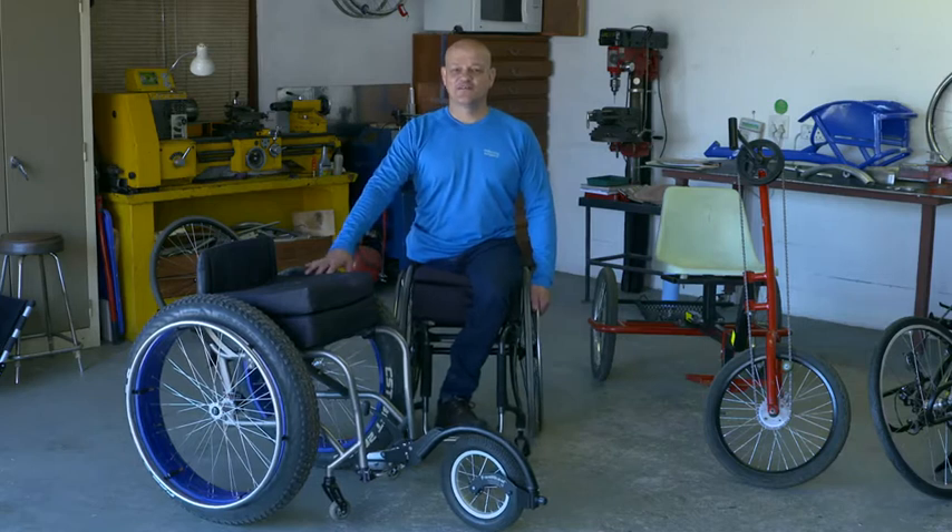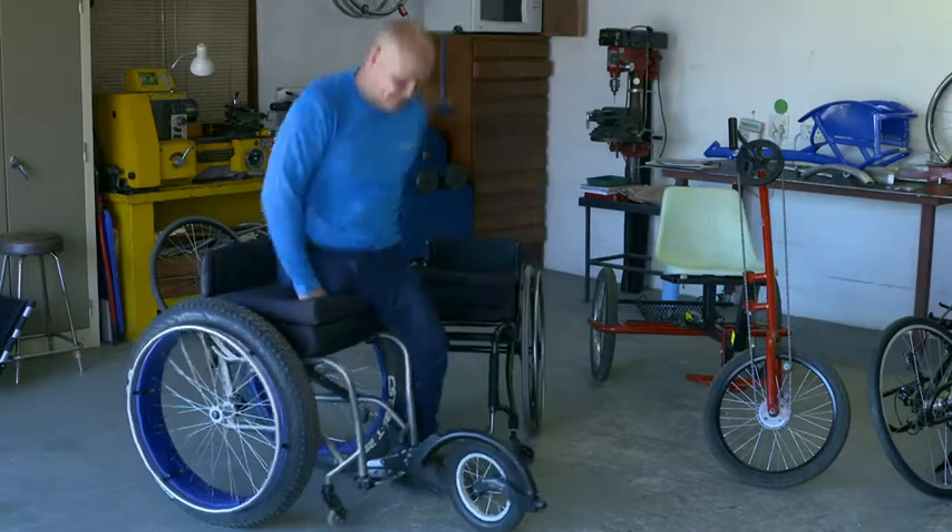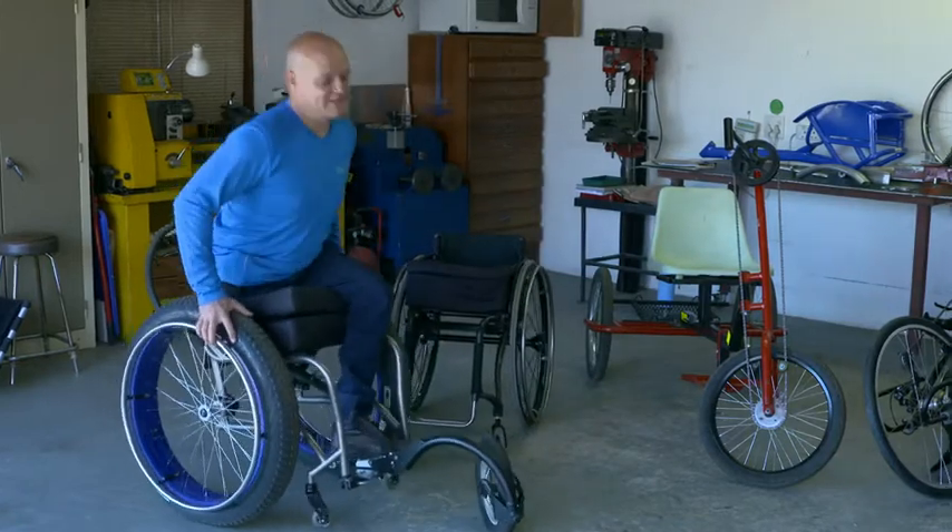This is my off-road version 4x4 wheelchair that you can use the fat tyre wheels on the beach with, and it's easy to get on and off. You just go.